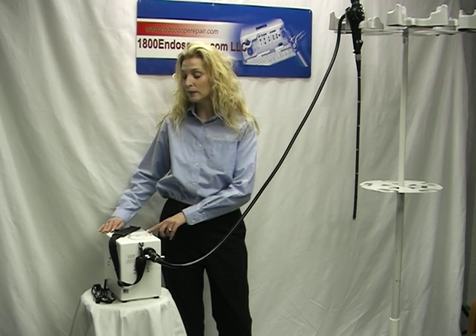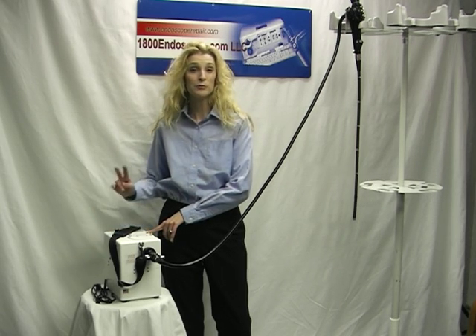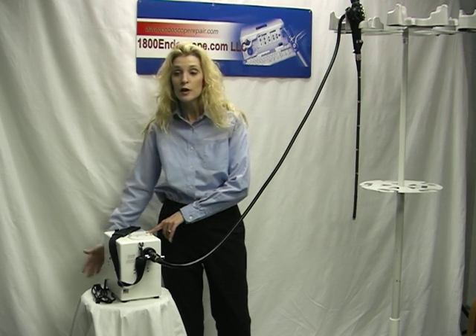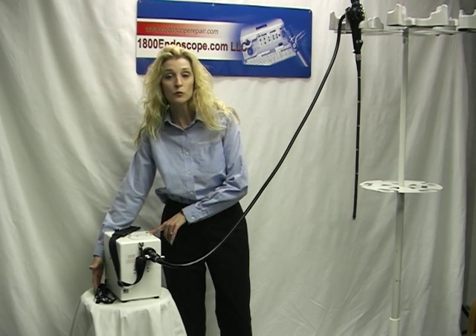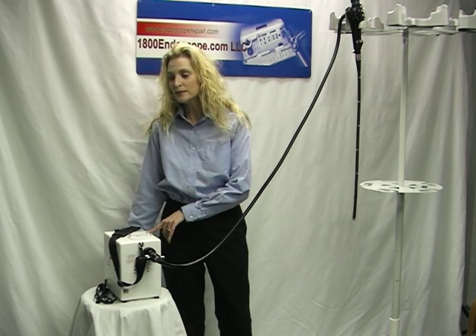Only weighing 8 pounds, it allows you to take it into the field. The battery holds charge for up to two hours of usage time. The battery can be recharged by the light plug included in the wall mount socket, or conveniently with the car charger in transit.